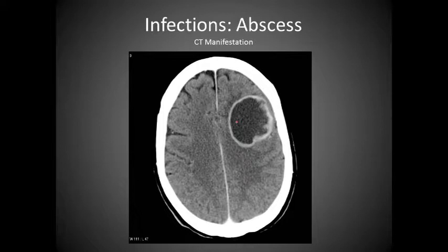And so what we presume is that this is basically the body trying to isolate itself, which causes all this hyperdense ring and enhancement and things like that. And so this is just a huge pocket of inflammation inside the brain. And so it would be interesting to see what these patients actually look like and when this inflammation is actually cleared up, or if inflammation ever became cleared.